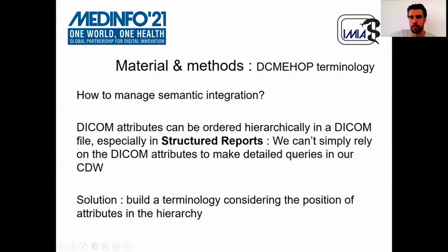The other question when integrating this data is how to manage semantic integration. DICOM attributes can be ordered hierarchically in the DICOM file, especially in structured reports. So we can't simply rely on the DICOM attributes to make detailed queries. The solution we found is to build a terminology considering the position of attributes in the hierarchy.